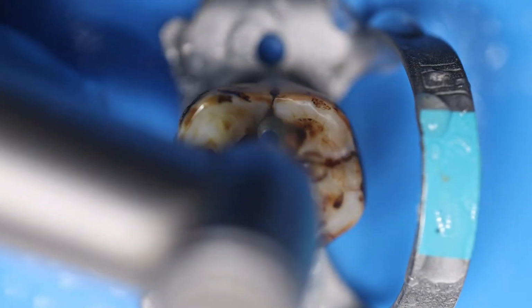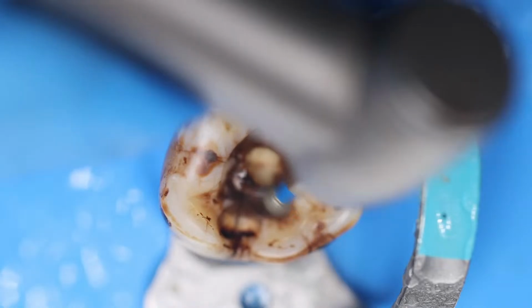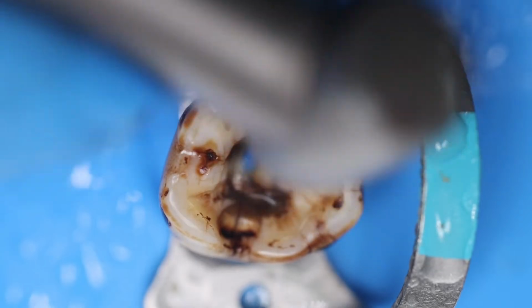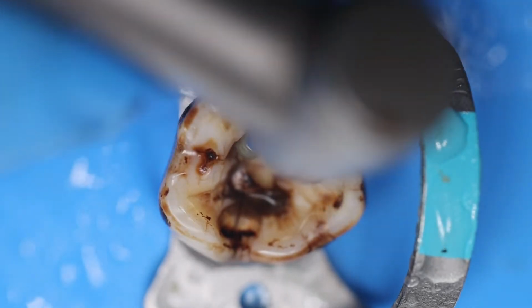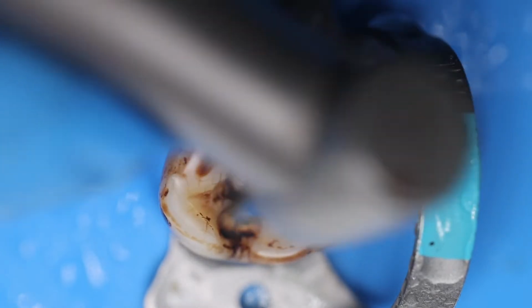And this is hard caries, this is not soft caries, so we need to use the burr over here, and we are using it at a slow speed so that we can understand how we are progressing into the tooth.